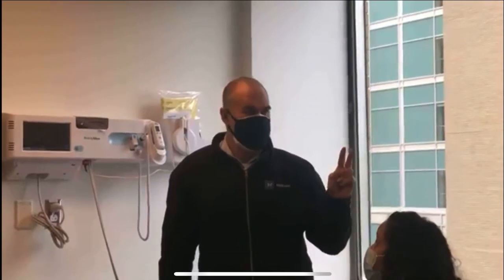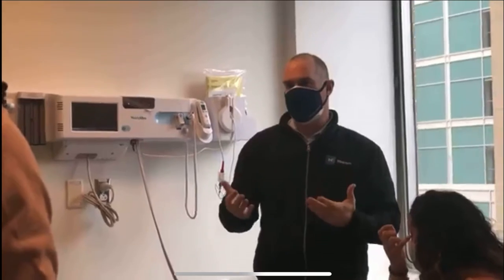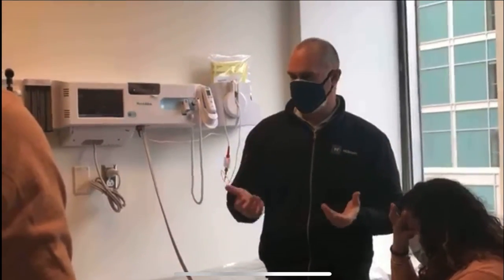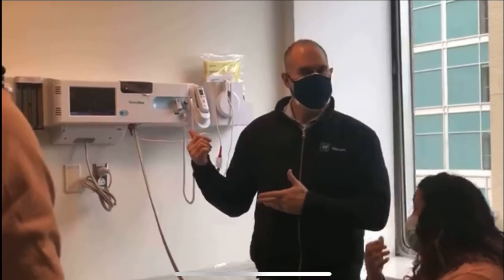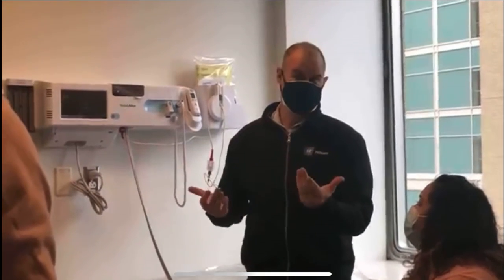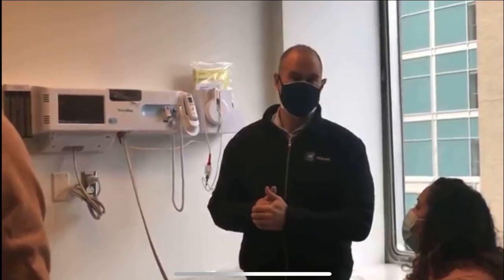Then it's going to wait a minute in between each subsequent blood pressure and average the next two. The reason we do that is because of white coat hypertension — the anxiety a patient might feel just by seeing a white coat, being in a doctor's office, that sort of thing. The American Heart Association recommends doing more than one blood pressure. This is a way to do it with a digital device that frees you up while the patient is still in the room.